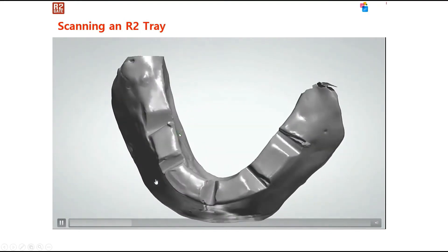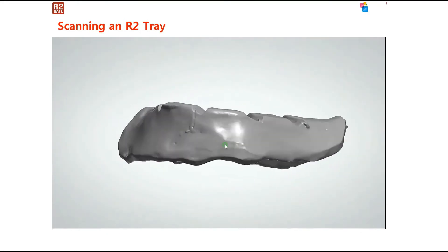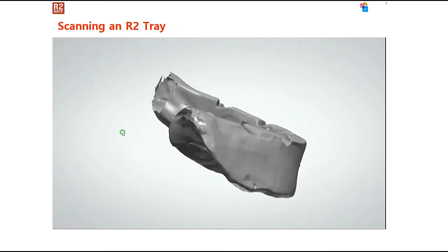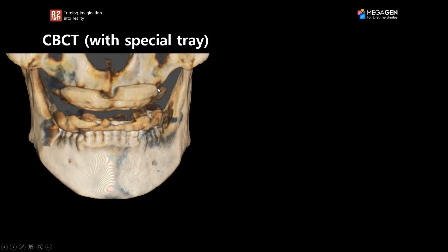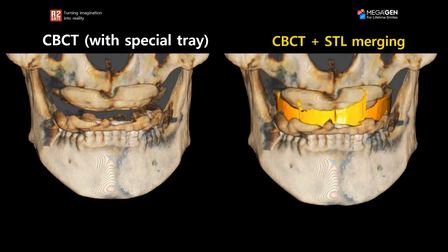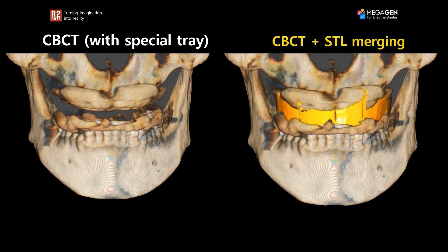The next step is to send the R2 tray to the lab, where they scan it. I also CBCT scan the patient wearing the tray. In the CBCT taken with the special tray, I can now see the base of the tray, which is the radiopaque resin. Since I can see that, the next step is to match the CBCT to the scan of the special R2 tray. Through the base of the tray, I find matching points and merge the STL file of the tray to the CBCT file of the patient wearing the tray.